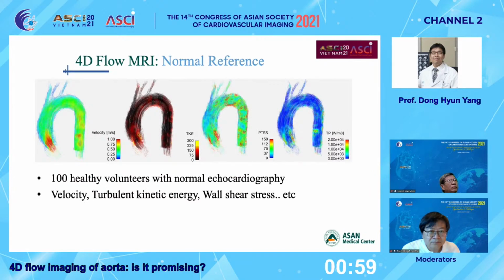This is an ongoing volunteer study at my institution. We are gathering normal hemodynamic parameters using 4D flow MRI from volunteers who were confirmed to be normal using echocardiography as a reference standard.